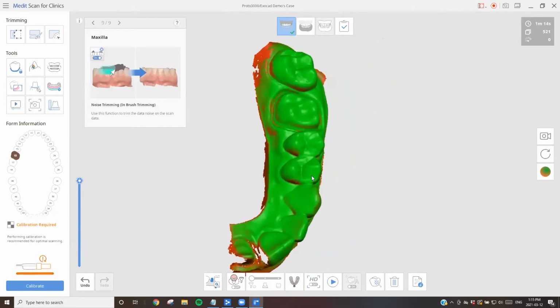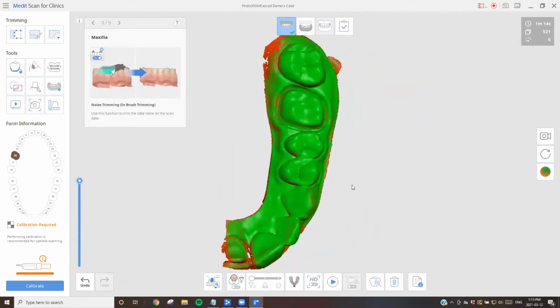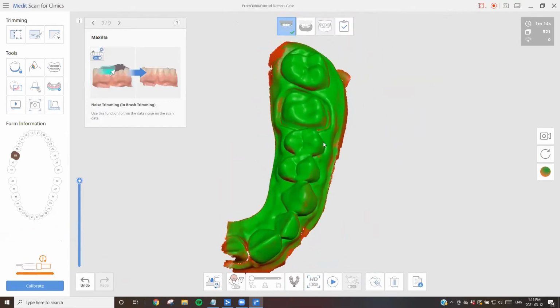so I'm going to quickly breeze over some of the great functions here that are more pertinent to the chairside workflow. So one example here is you have the instructions on where to scan and what to scan in this top part here. So you have your upper arch, you have your lower arch, you have your bite scan, and you have your completed form. If for whatever reason you accidentally scan the wrong arch, which can happen, you have a swapping function here. You have a results preview.